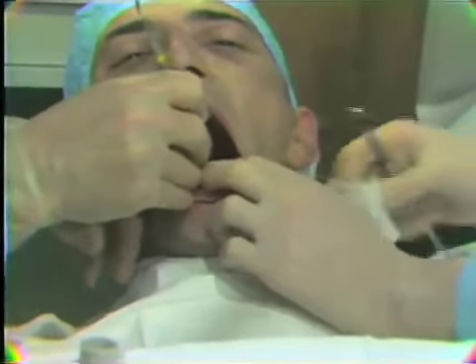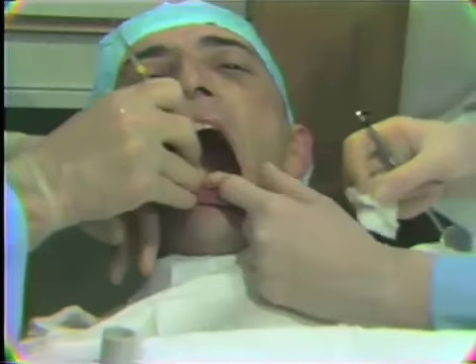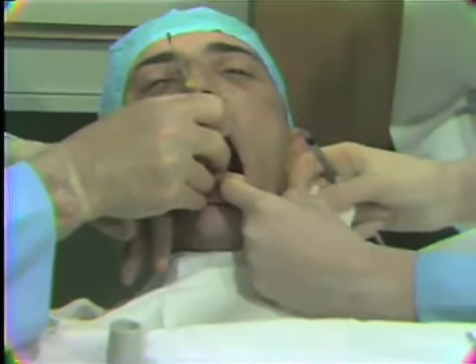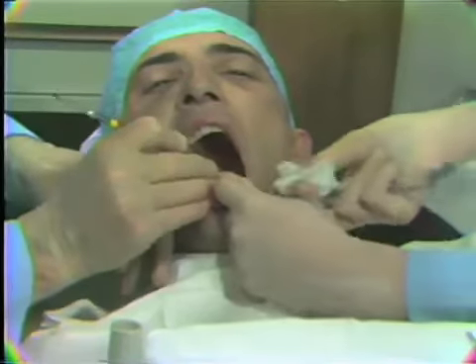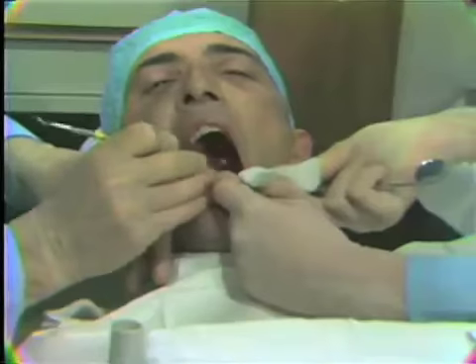We attempt in manipulation of the plastic instrument to carry the dressing into the interproximal areas, utilizing the interproximal areas for retention for our dressing. There will be bits and pieces of dressing that the assistant will be able to clean off of the plastic instrument.